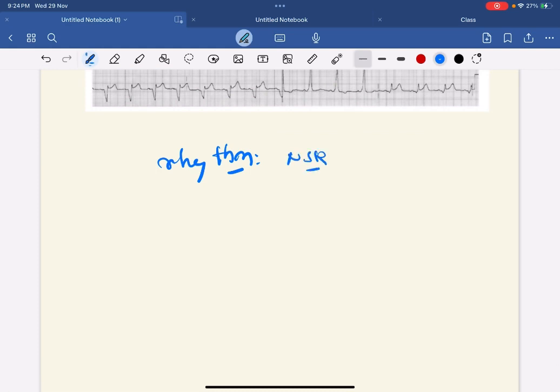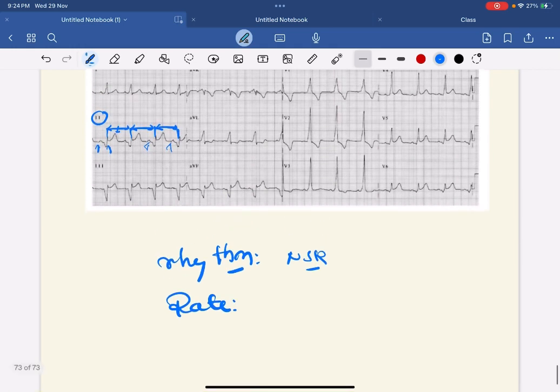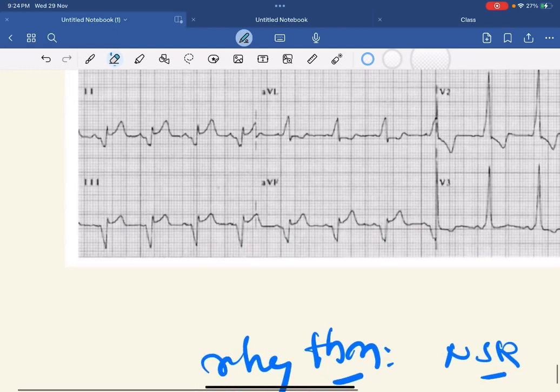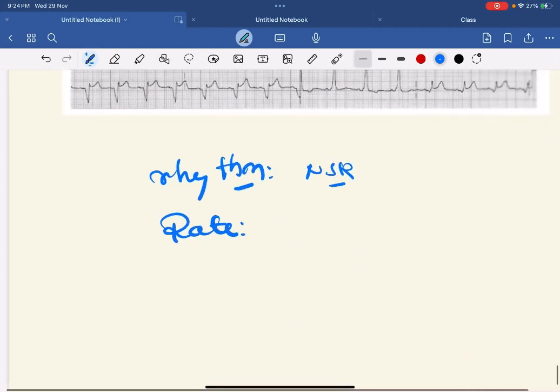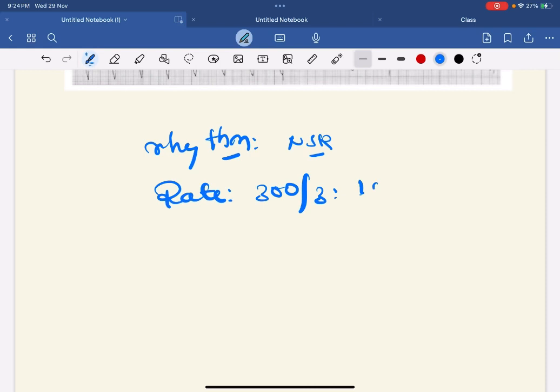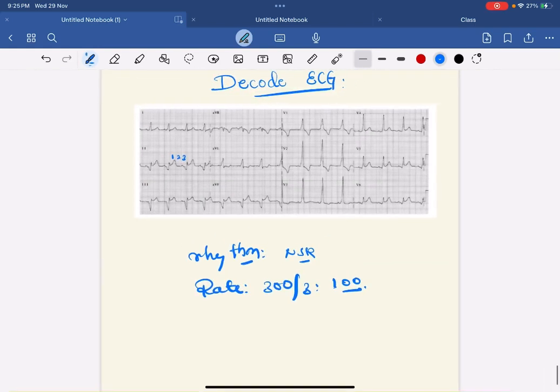Then you have to calculate rate. Again you have to see lead II, how many boxes between RR interval. One big box, two big box, three big box - it's around three. So rate is calculated by 300 by 3, it's around 100, borderline tachycardia.